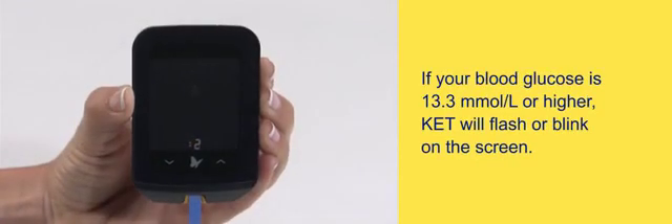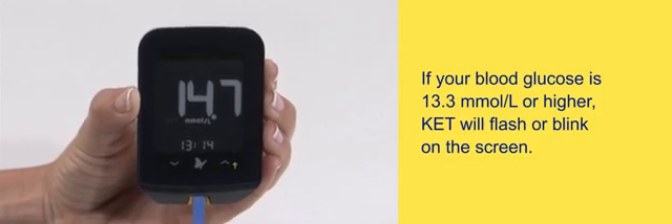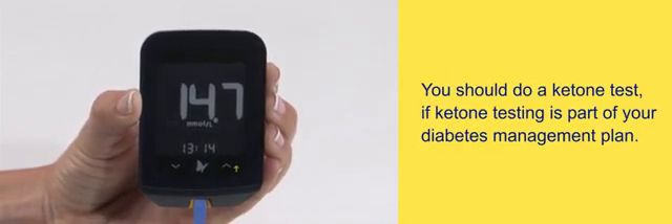If your blood glucose is 13.3 millimoles per liter or higher, KET will flash or blink on the screen. You should do a ketone test if ketone testing is part of your diabetes management plan.